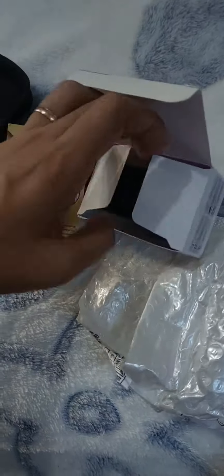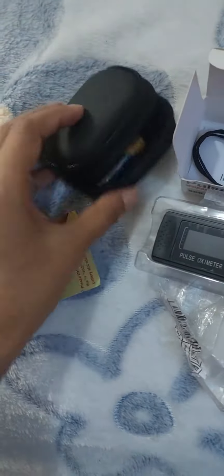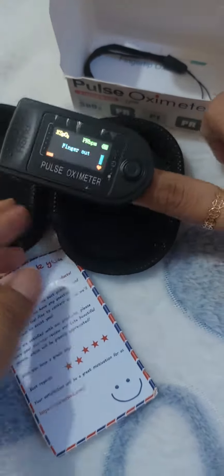Last year I was diagnosed with mild tricuspid valve regurgitation, and so I decided to monitor my own heart rate and oxygen. If you buy this item, you can buy the pulse oximeter alone or with a case. It also comes with a battery and a sling.